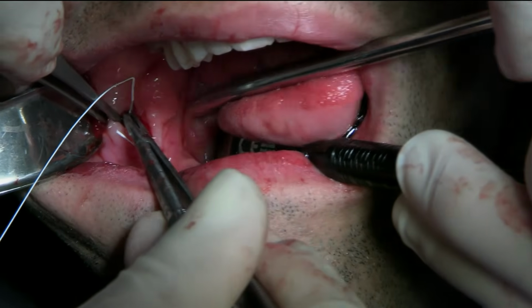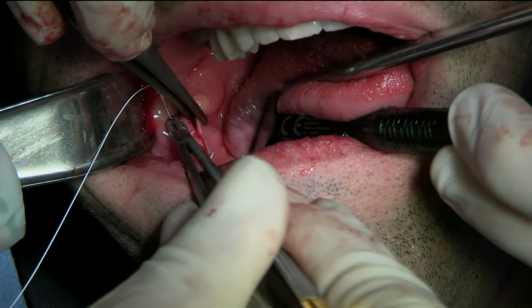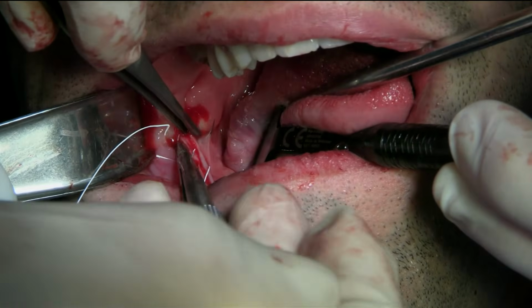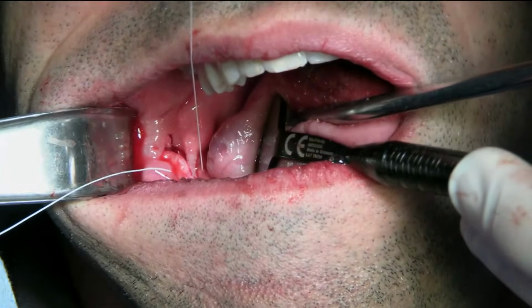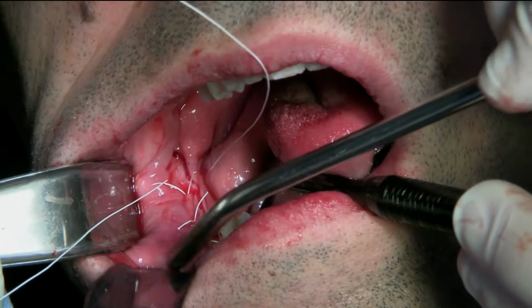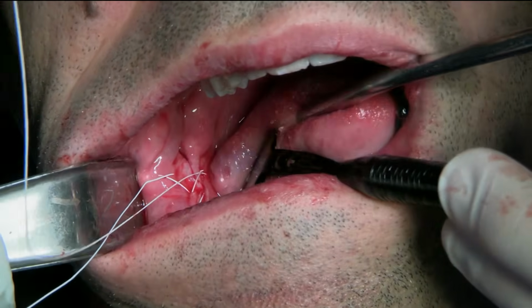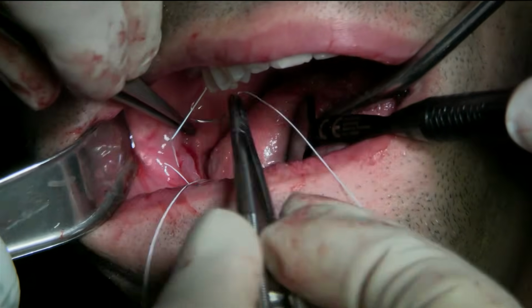There's no membrane here anymore, so I don't even need it, but I'll do one more, just to be complete. So how many mattresses do I have? 4 or 5? This is the 4th, okay. So we're going to place 4 mattress sutures on this quite long incision.